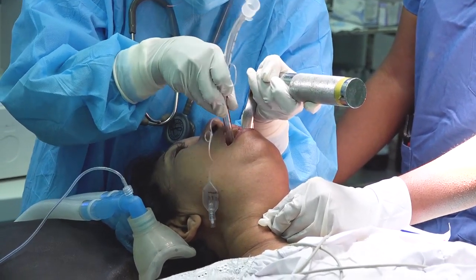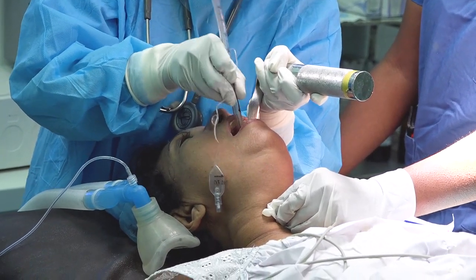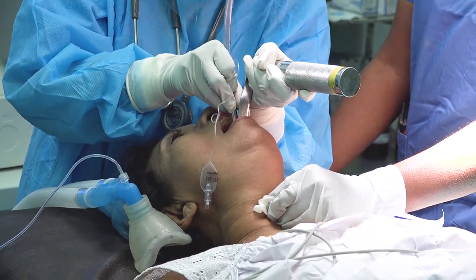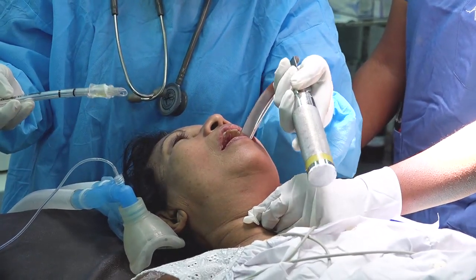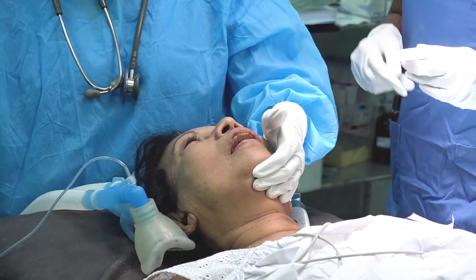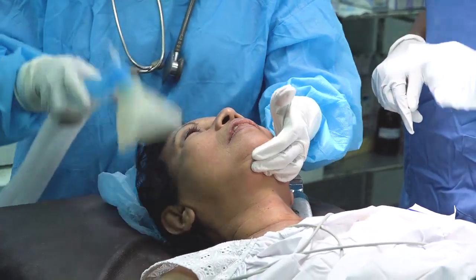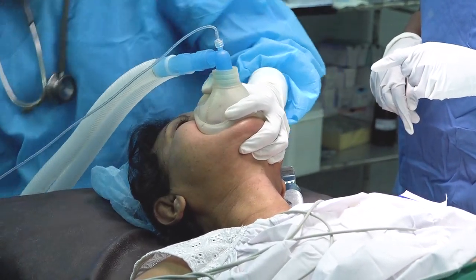Insert the laryngoscope blade gently into the right side of the mouth, displacing the tongue to the left side and into the submandibular space. Now, gently slide the laryngoscope blade down the midline till the tip of the Macintosh blade lies in the vallecula, which is just anterior to the epiglottis.